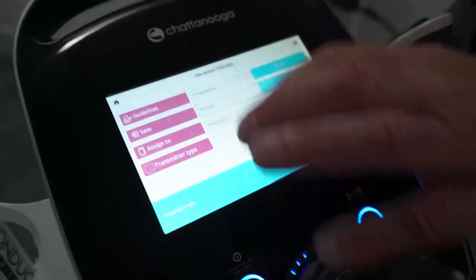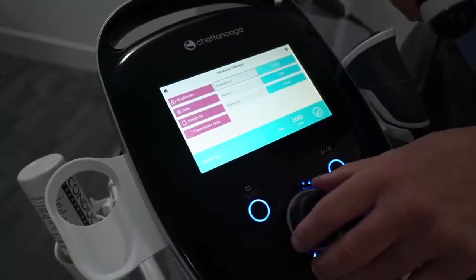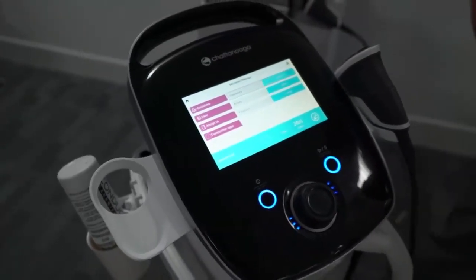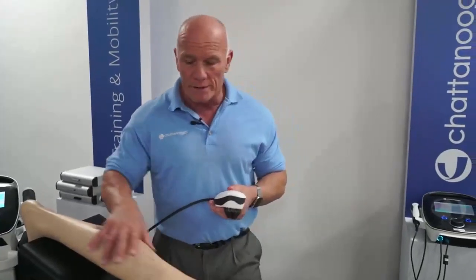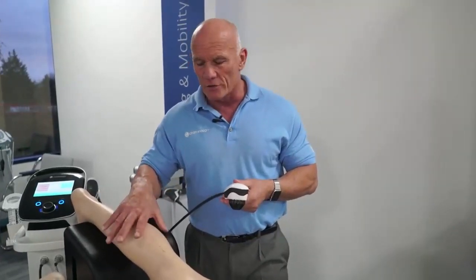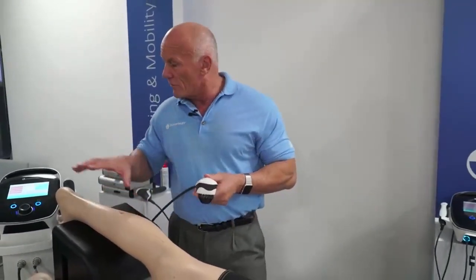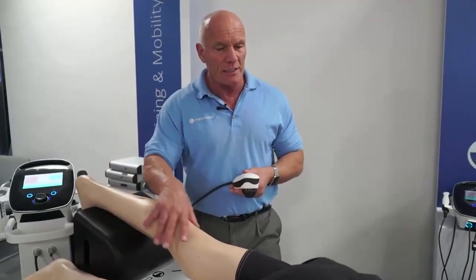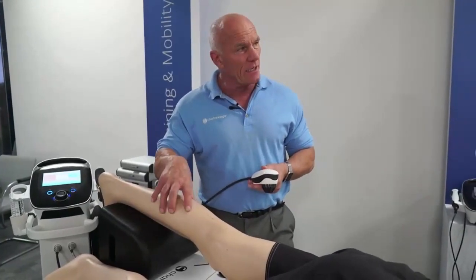I told you it was a good screen, very sensitive, up to 35 hertz, we can increase tone. So if we have a hypotonic muscle, we can actually increase tone within the muscle. Very good for certain patients. If you're working in a sport setting, you would use that range for increasing blood circulation, exciting the neural system, increasing tone within the muscle. So it's preparing you for competition.